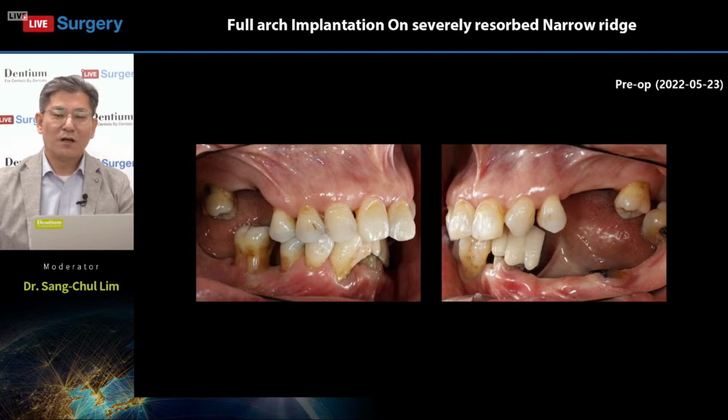As you know, in a full mouth rehabilitation case it is very important to keep the vertical stop and vertical dimension, right? So in this patient, fortunately, the two premolars work as a vertical stop, and all the information is preserved by these two premolars.